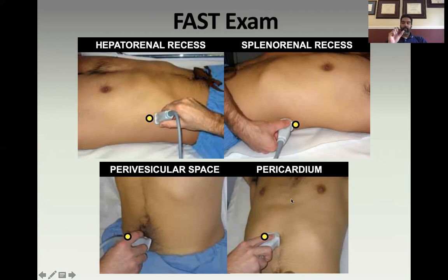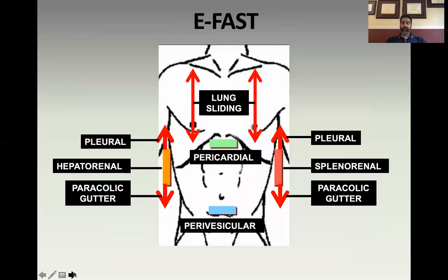So the dot is switched when compared with cardiac; the dot is switched to the other side. In this case, instead of doing your normal subcostal cardiac view where the dot points to the patient's left side, you point the dot to the patient's right side, and that will preserve the anatomic orientation of the subcostal cardiac view.